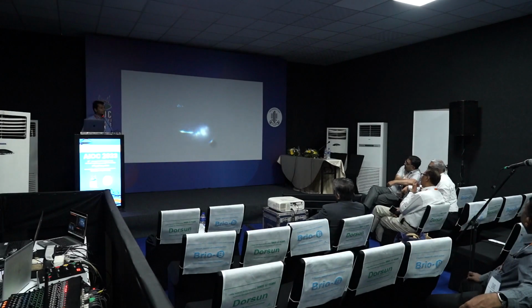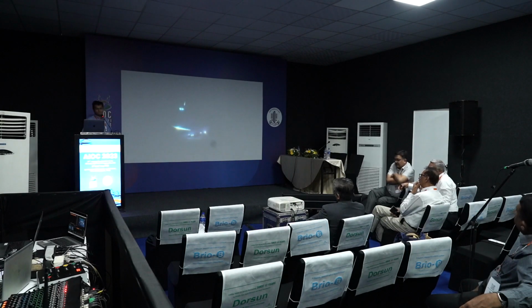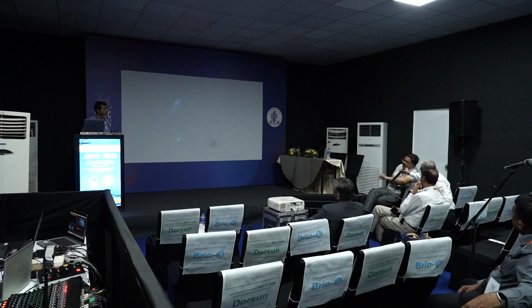So lensectomy, I mean lens removal, I don't usually do lens removal in a kid. We also don't. I agree with you totally. I avoid it as far as possible. Now, because of wide angle systems and reasonably good illumination, generally we do not need to. Previously, almost all cases. So again, I'm doing a retinectomy to all the areas of traction, and primary capsulotomy when you're doing the cataract.